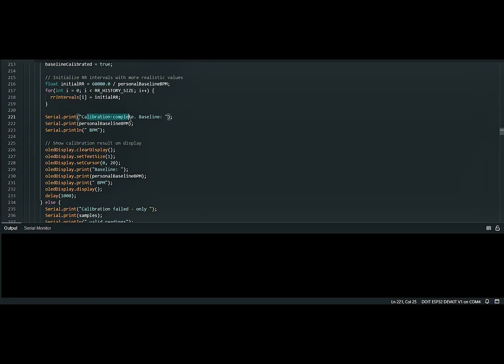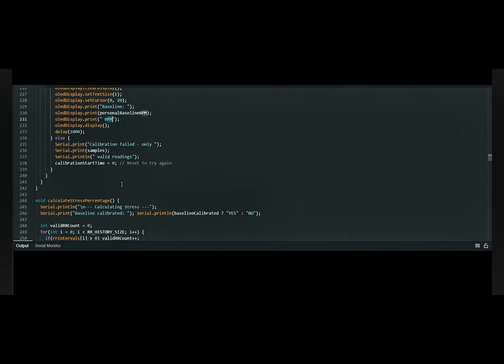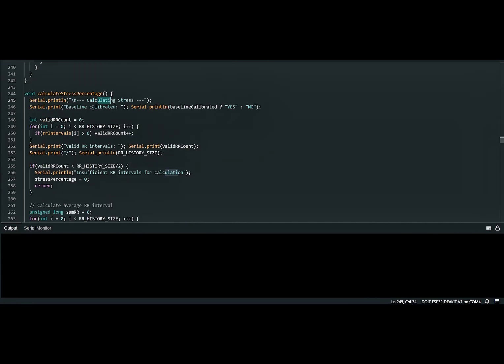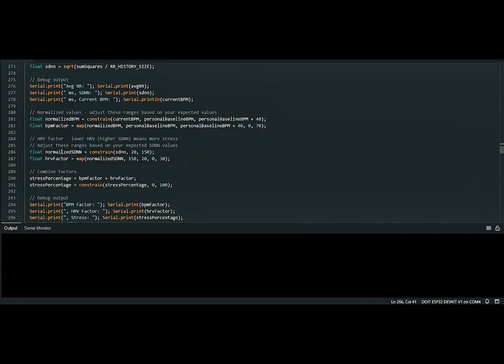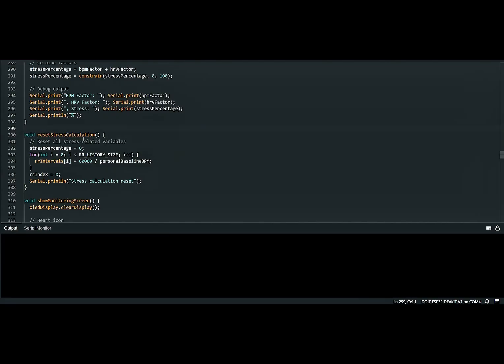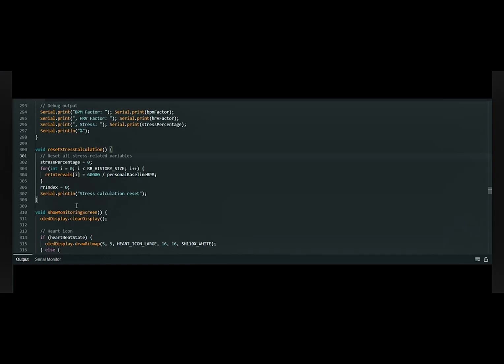Next part is the calibration for the device. So this is long code for the calibration of the BPM and the stress, and some variables that include the BPM and stress. Void calculate stress percentage. So it will calculate the stress percentage from the BPM and some variables. Next is the reset stress calculation. It's the part after the calibration part. So it will check if the state is working or not working. Whatever, it will reset the stress to zero.